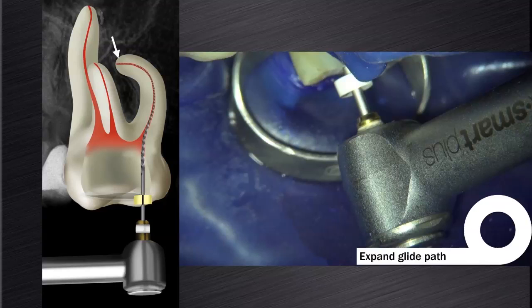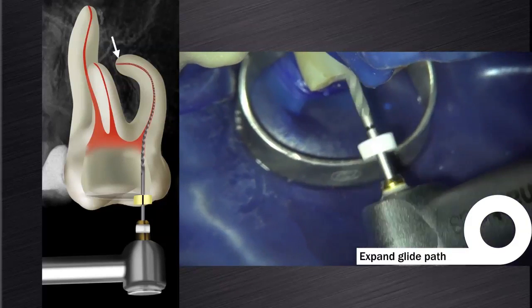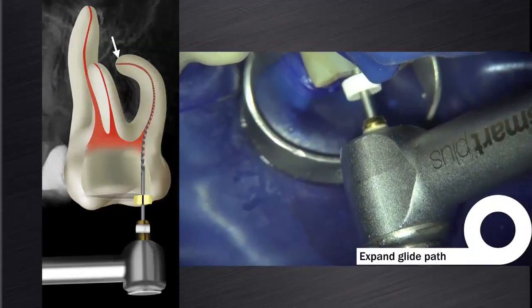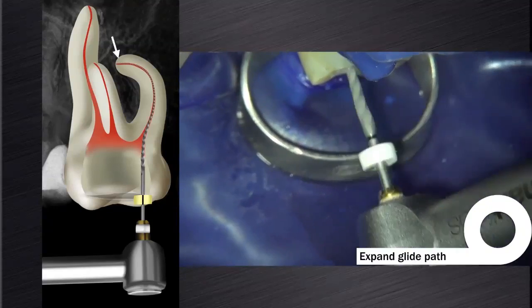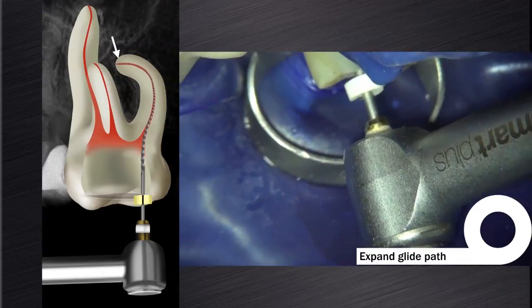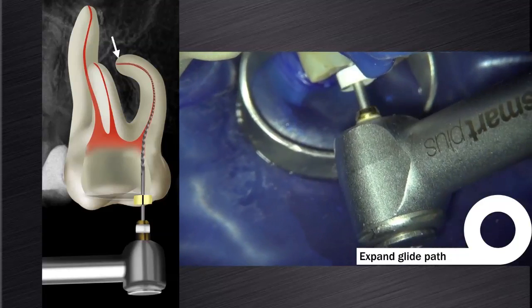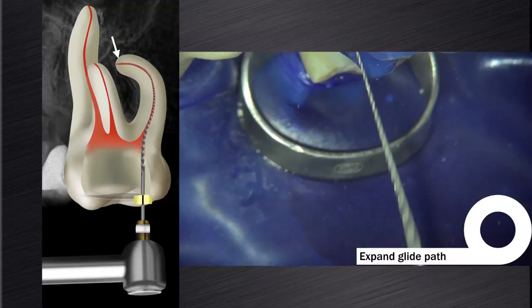Once we achieved working length and made a size 10 K-file loose to create a reproducible micro root glide path, then you can go back to the ProGlider to expand the glide path to full working length. On this video you can see that I am using small backstroke brushing motions to expand the glide path before we do canal preparation with the ProTaper Next instruments.